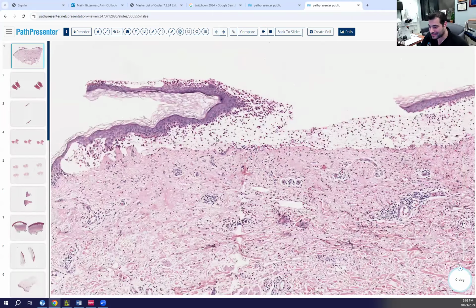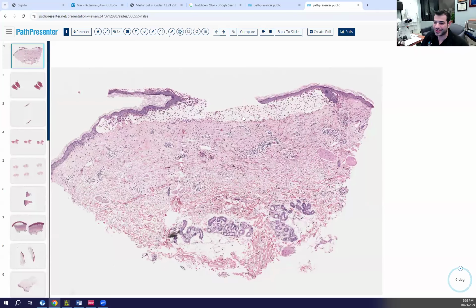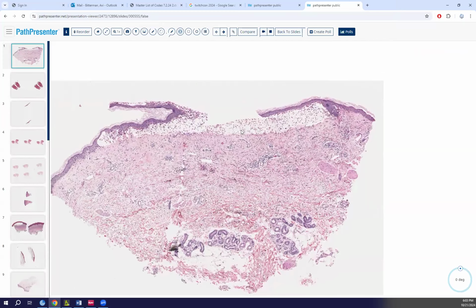As far as bullous arthropod, what's not good for bullous arthropod here? You need to have like a periacrine infiltrate, or the EOs would be a little bit more deep down. Deep is the key thing. The infiltrate goes deeper, and look how clean this split is. Very clean.